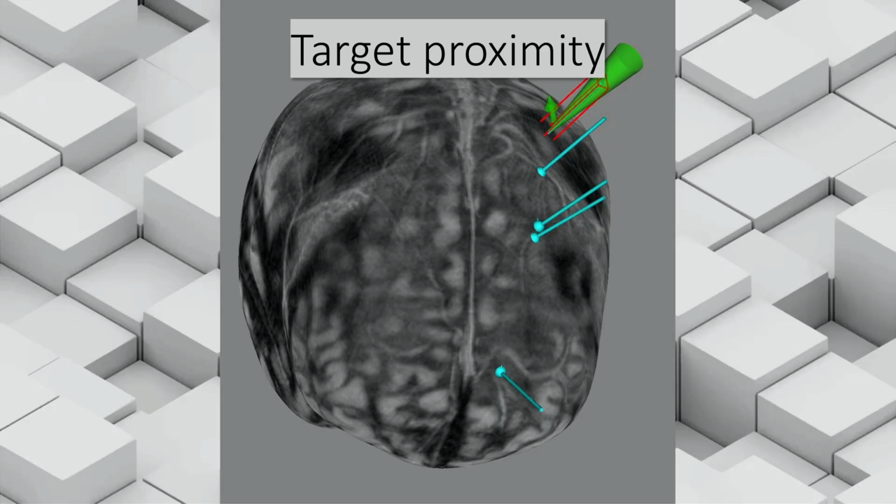For example, right now I'm testing that positive versus anti-correlated target. How well does it engage subgenual cingulate? And I have to make decisions about moving off of a target that looks like a pretty good blob because its valence is not consistent. So it depends a little bit on your hypothesis, but if you really want to discriminate the targets for condition A versus condition B, say for example, you don't want them to really lay on top of each other, and if they do, you might have to choose your second best target when they overlap.